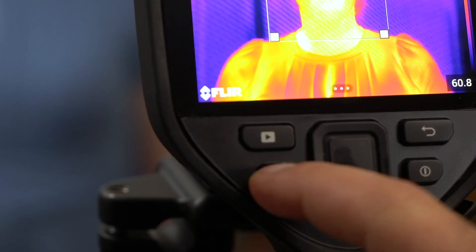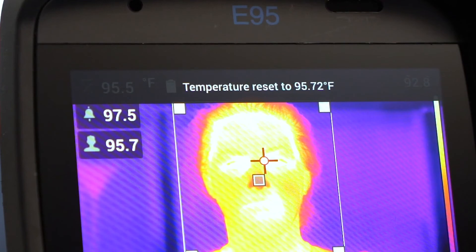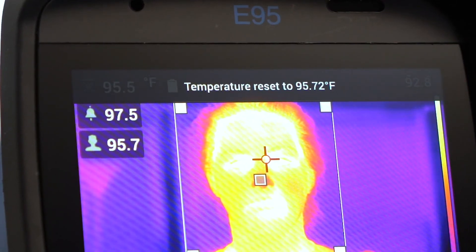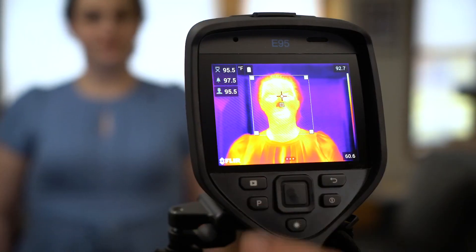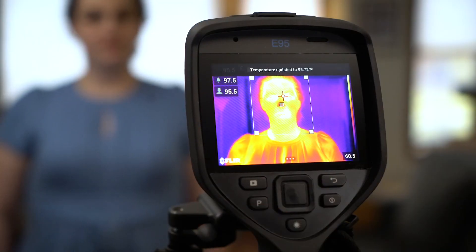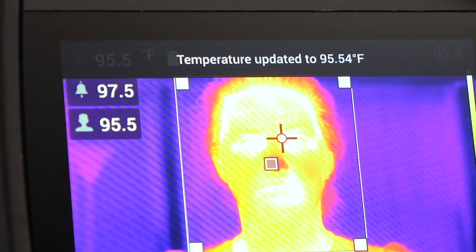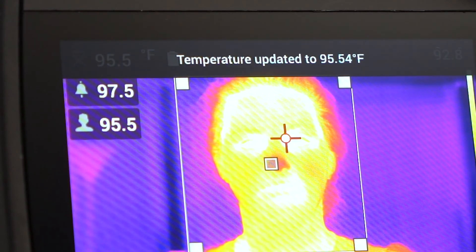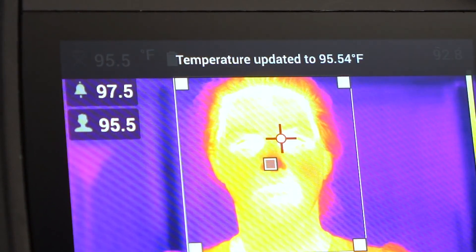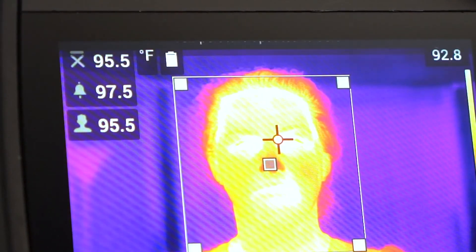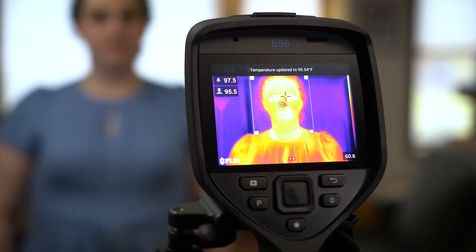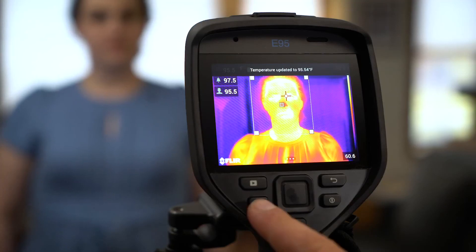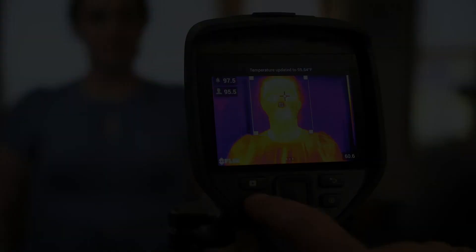A long press of the P button resets the baseline temperature. A short press of the P button averages in a new sample. It's recommended to average at least three samples from healthy individuals. The camera can store up to the last ten samples.